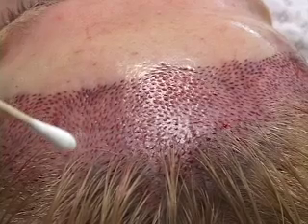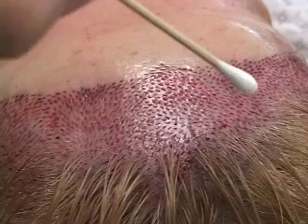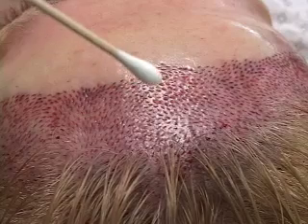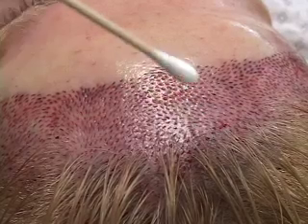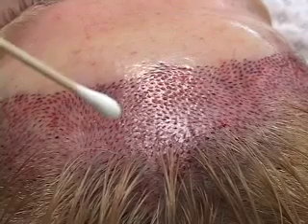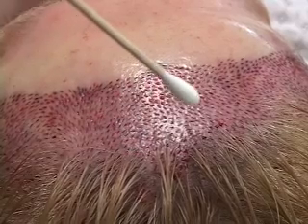You see these grafts go forward, curl down, and then curl up, and then curl back down again. What you're seeing is the continuation of some of these grafts that curl back up this way like a cowlick. And again, these are almost the opposite of what a male hairline would be, both in the shape and also the distribution and pattern of the grafts. As we go back this way, they swirl back up here.